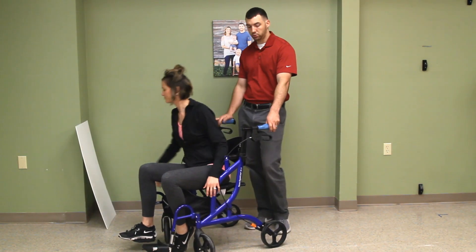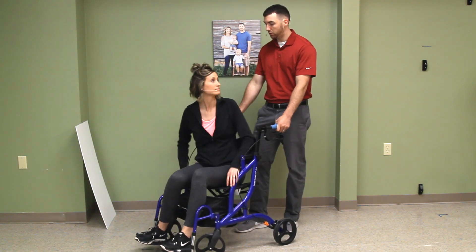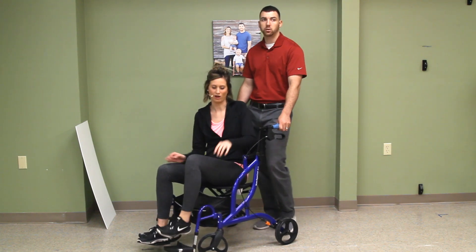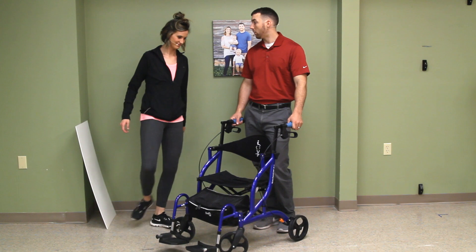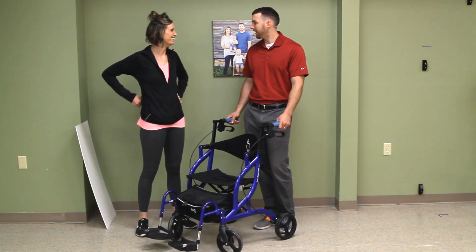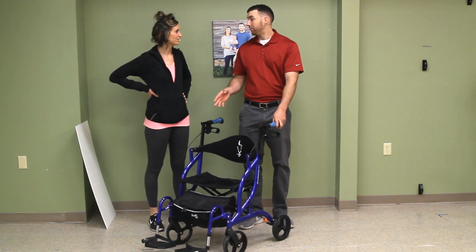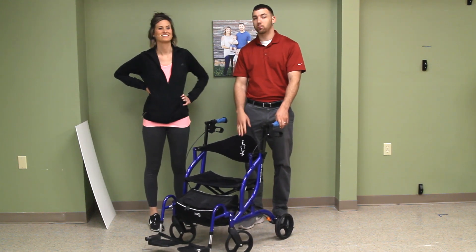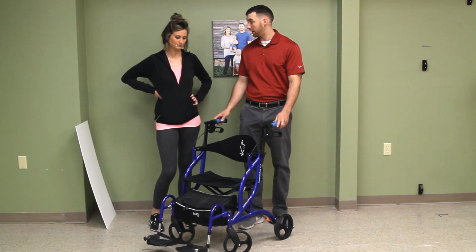For those grandparents out there — those grandparents you want to come to your kids' sporting events, or the graduation, or you just want them to be around — you want them to come downtown and have a good time. This is a way you can bring them. Some grandparents get out and do it. This is the Hugo Navigator Rollator and Transport Chair. It's two-in-one features and we're going to get into it.